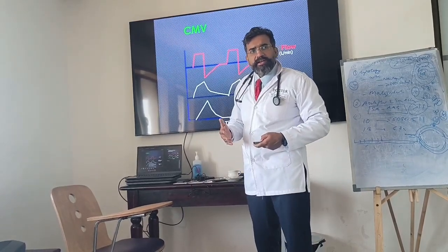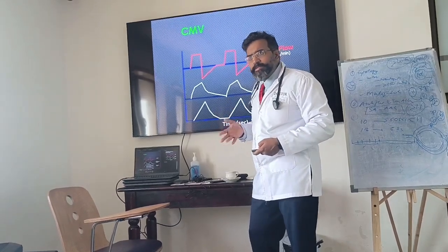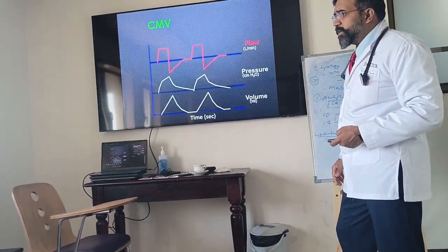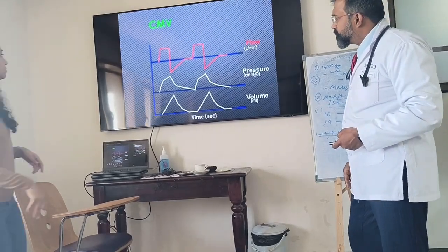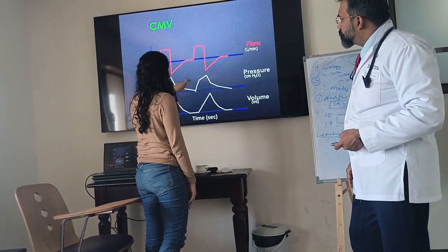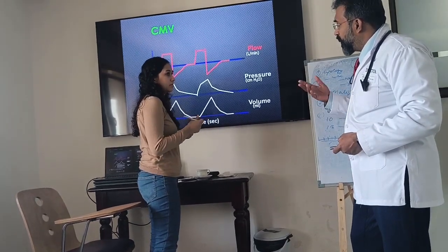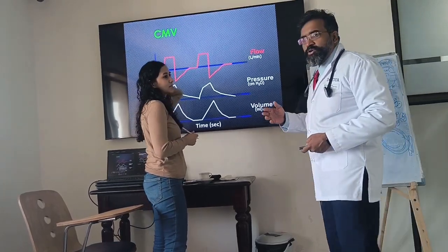Okay. And then cycling is conversion from inspiration to expiration. Where is it converting from inspiration to expiration? Alia, come and show me. Which point is it converting from inspiration to expiration? Come, put your finger and show us. This is your inspiration, and from here comes expiration. So how do you find inspiration and expiration here? What is expiration? From inside to outside? It's ulta. What is ulta here? Ulta is lower.